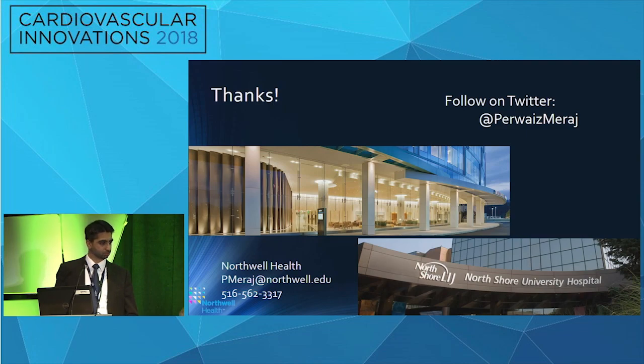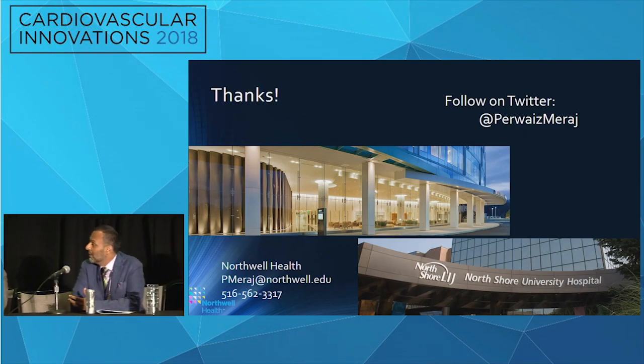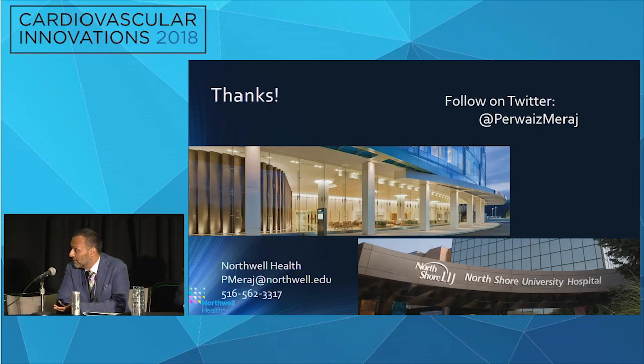We typically try to avoid using guide catheter extensions with atherectomy, I'll be honest with you. It's not that we've never done it, we really avoid it. Most times you don't need a whole lot of guide support for atherectomy, which is the advantage of it. Sometimes you get into these issues where you have a distal right that's tortuous and heavily calcified, and you just don't have the push. Right. That's the example I'm thinking of. I actually did one yesterday. I had to put a guide extension all the way to the base of the heart.